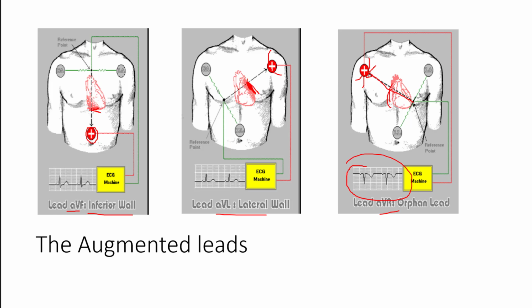Well, like we mentioned, if we're capturing activity in the same direction as the activity is produced, the waveforms on the ECG will be positive. If we're capturing activity moving away or in the opposite direction, like we do here, they're going to be inverted. It's going to be flipped. We have an inverted view, basically, because we're placing the positive terminal on the right side, and activity is occurring in this direction, yet we're capturing activity oriented going in this direction. So the view will just be inverted, right? It'll look similar, but just flipped, because the orientation of our lead, our capturing signal, is opposite of the direction of that vector.